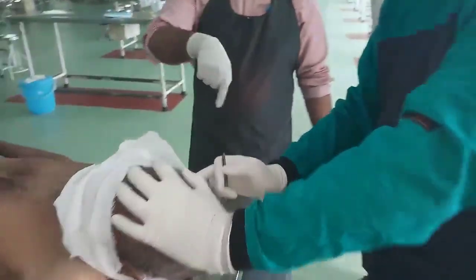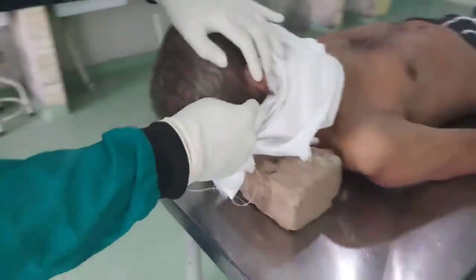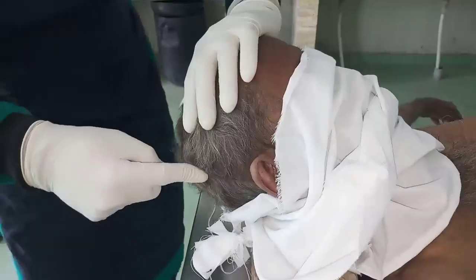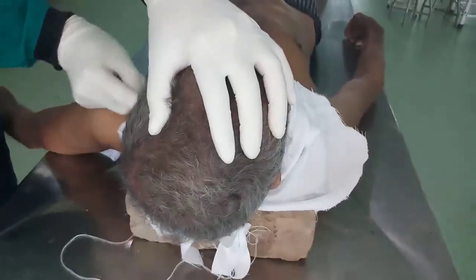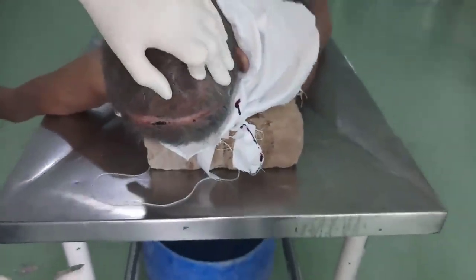See, this is the mastoid process. I am starting my incision from one mastoid. It's going over the vertex toward the other mastoid. Okay. So this is the first incision.